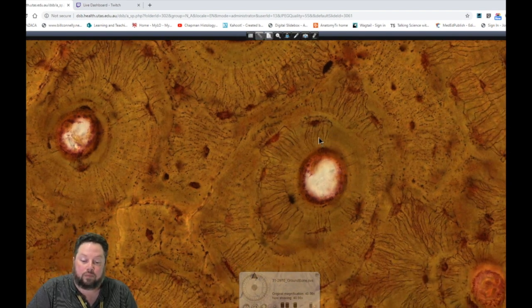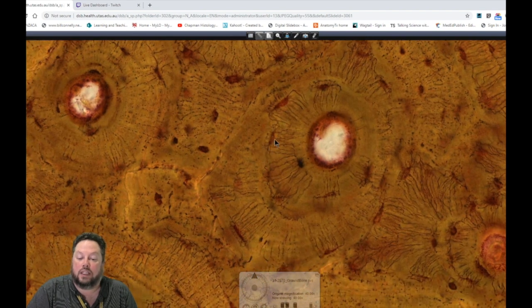These bones form these rings of bone tissue known as lamella, and within an osteon they're known as Haversian lamella, and they form these circular rings, and at the junctions between the lamella we find the lacunae, and then you can see these little canaliculi running in. As I said, this space is the Haversian canal, and this would normally be lined by endosteum, which is a layer of tissue made up of osteoblasts, osteoclasts, and osteoprogenitor cells, but also carries blood vessels within it.